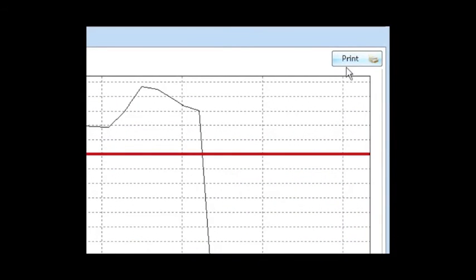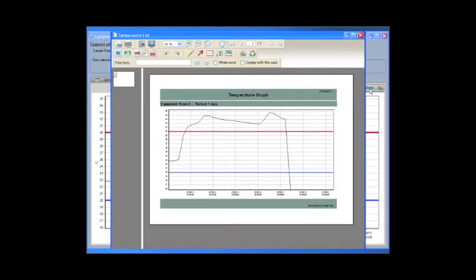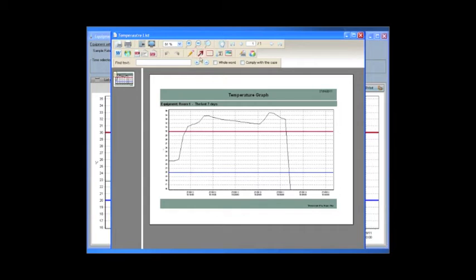You can print the graph, add comments before printing.